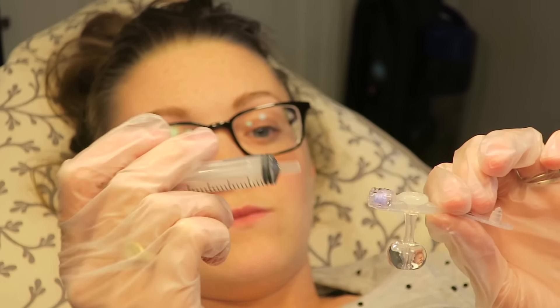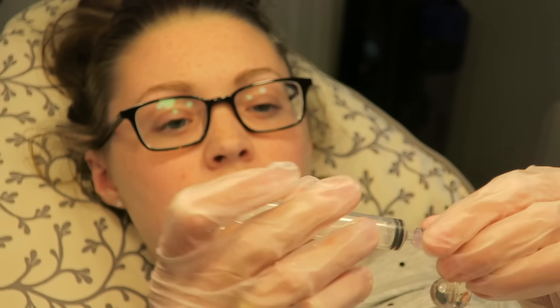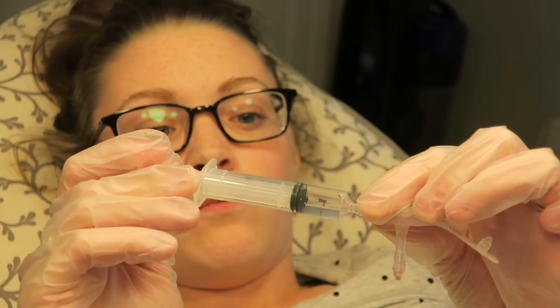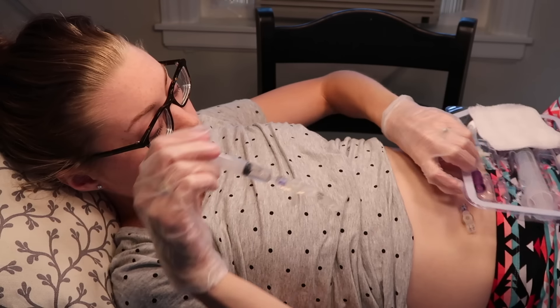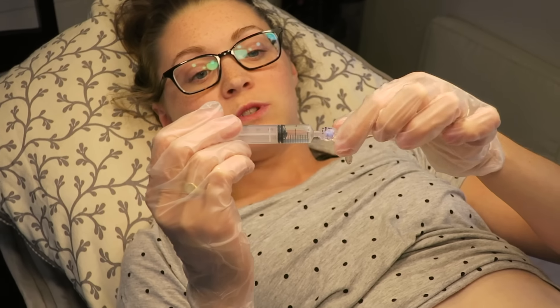Looks like the balloon works. So we're going to deflate the balloon, and this is actually what we're going to do to Mary's old one before we take it out. This is also what I do every Wednesday — I deflate my balloon but leave the button in place because I'm supposed to check that the amount of water I put in is the same amount at the end of the week.